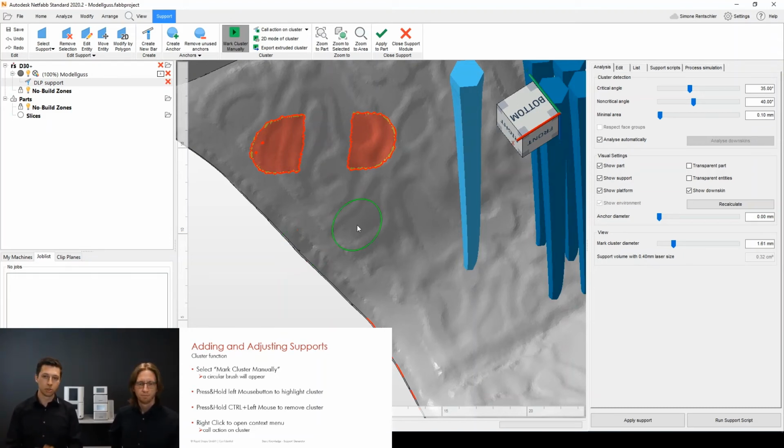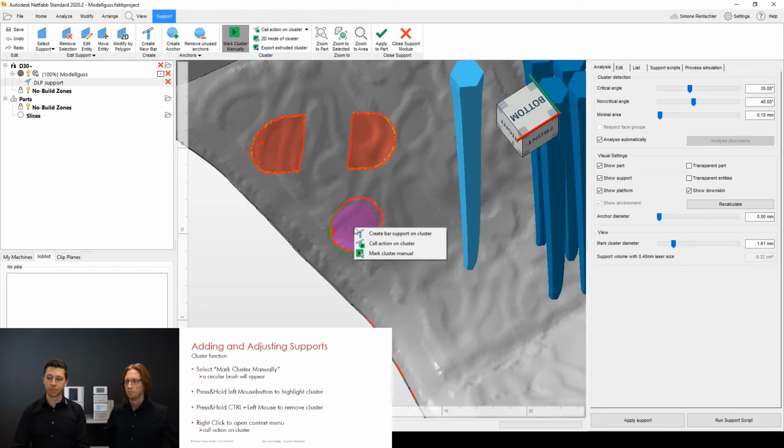Of course, I can also just click once and I will have a circular cluster manually created, but most likely I will mark a whole area. So what is now the purpose of this manual cluster? I can see there's a cluster, but what can I do now? So the easiest way to do something with a cluster is do a right click with the mouse on it. And you can see now, oh, there's some actions I can do.